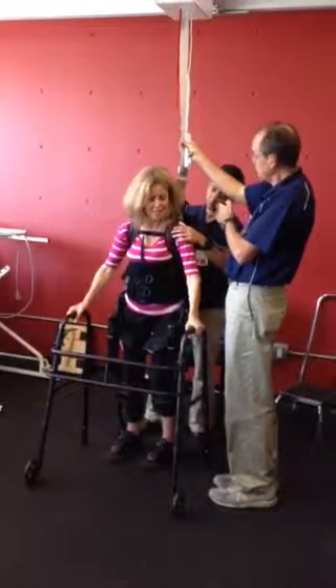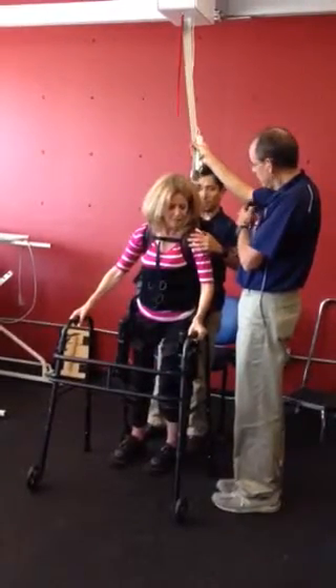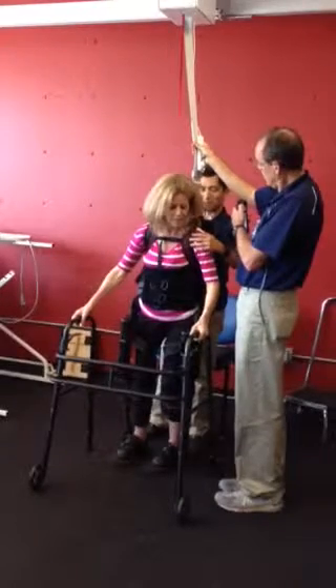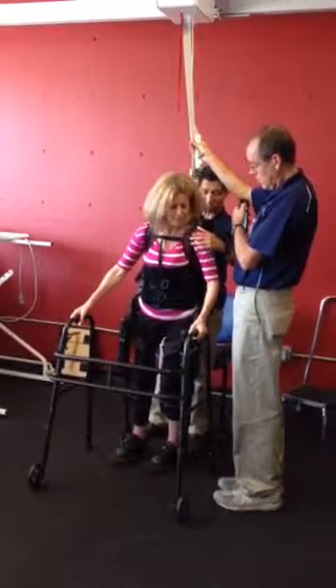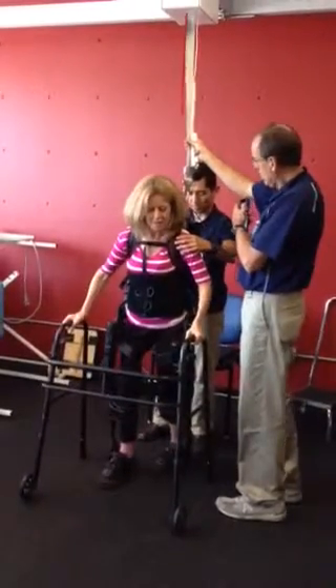We'll just take it really slow. Straight left. A little bit more. Right there. We're going to hold this. When you hear Michael say step, he's going to press it. Step. Good. Good.